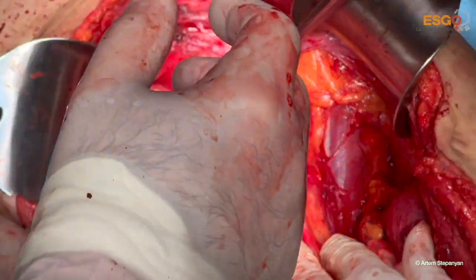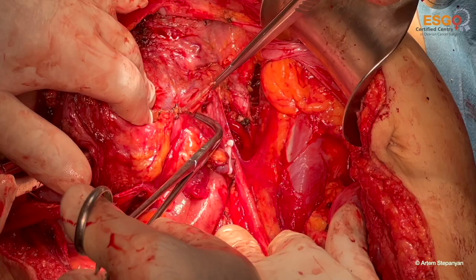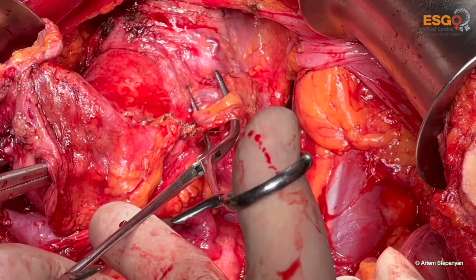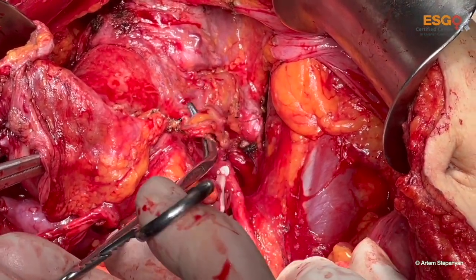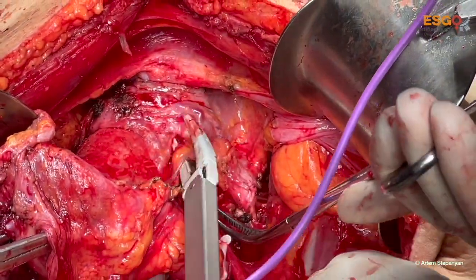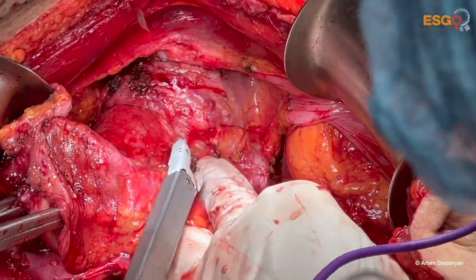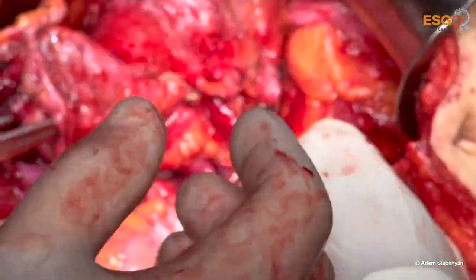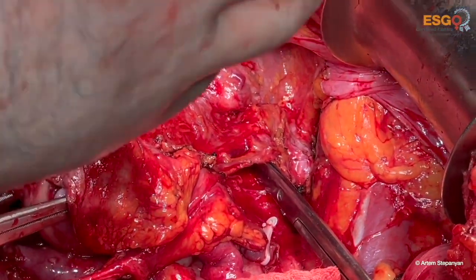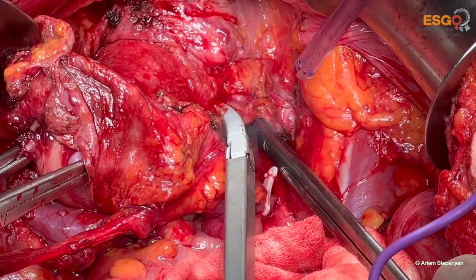We do the same on this side. The uterine artery was preliminarily cut, and here we have a small portion of the ureteral roof. We tunnelize the ureter and we cut its roof, staying. It's good to protect the ureter prior to application of the ligature.